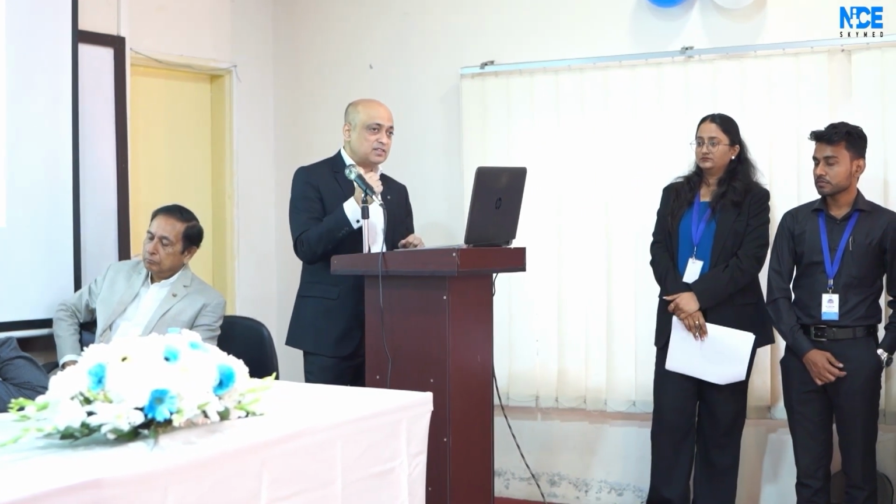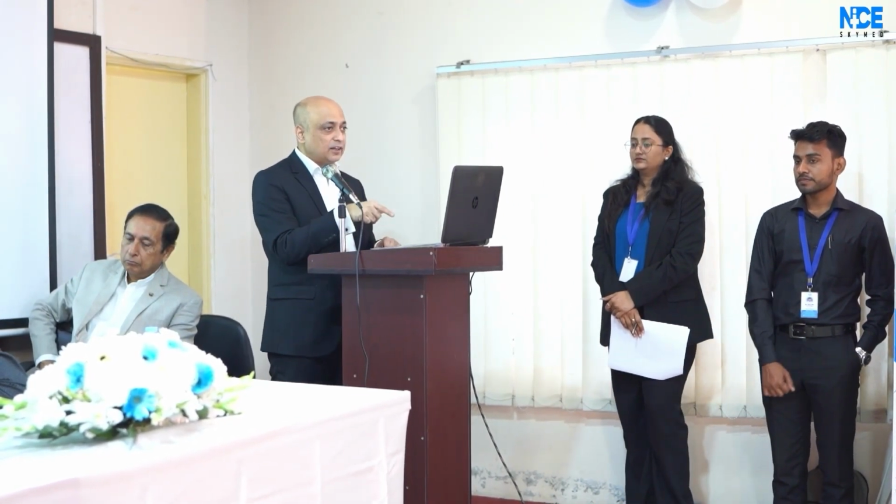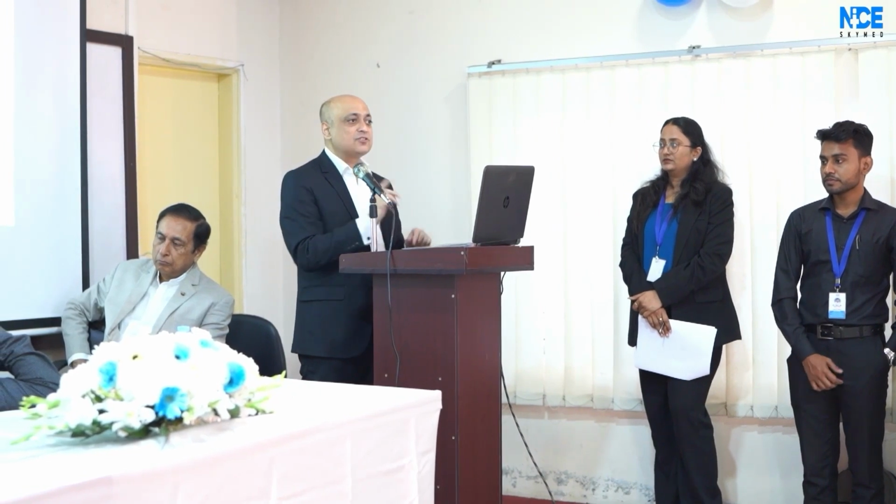So this Impella device is now a class 1 indication for patients with myocardial infarction with cardiogenic shock. So what is shock? Any patient on noradrenaline, any patient who requires inotropes, is in shock. That is the definition actually. So even if a person needs 2 ml or 1 ml of noradrenaline, he is in shock.